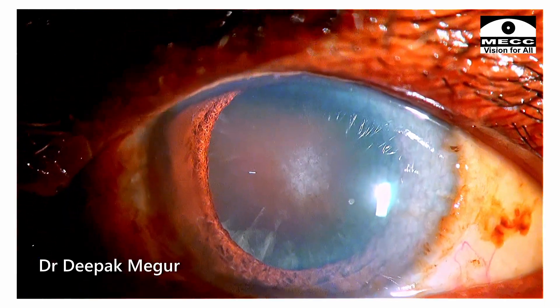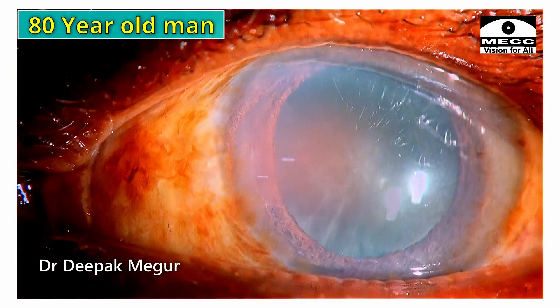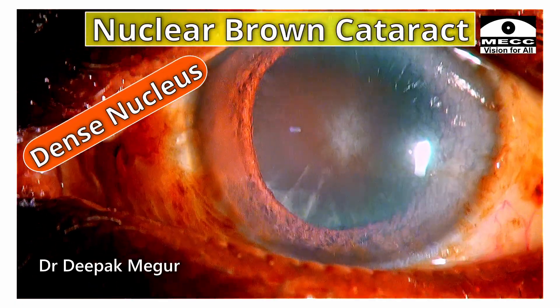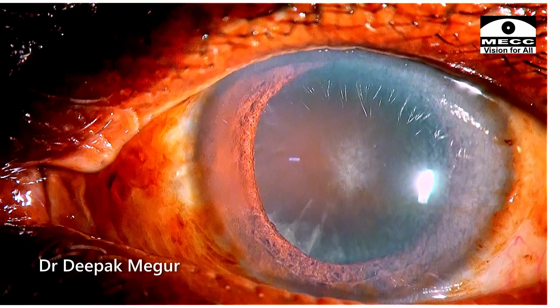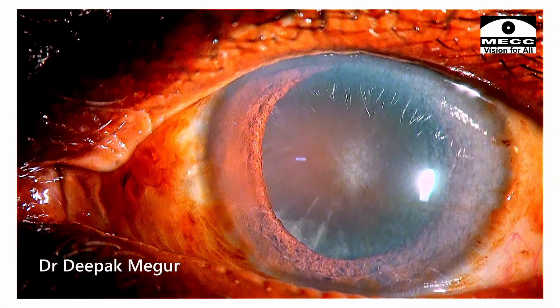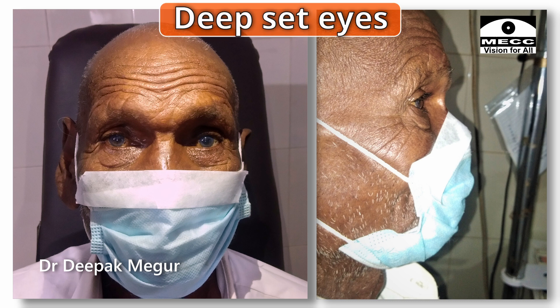Welcome to yet another challenging case. He is an 80-year-old patient with bilateral brown hard cataract. The nucleus is about grade 5. The cornea has a prominent arcus, and he has got extremely deep-set eyes.